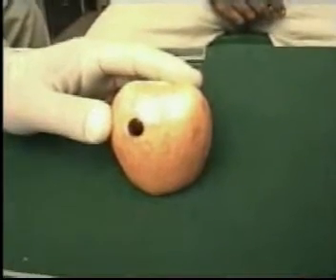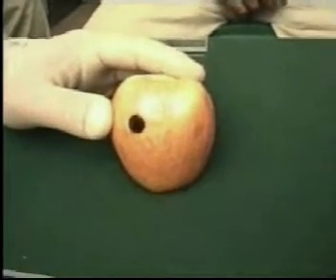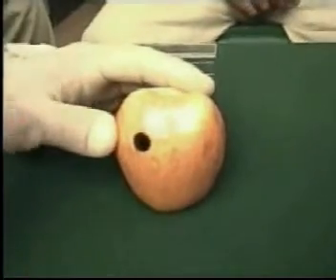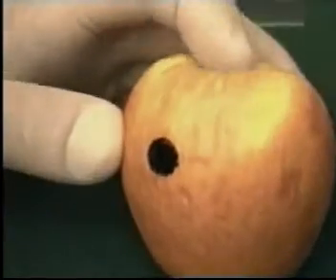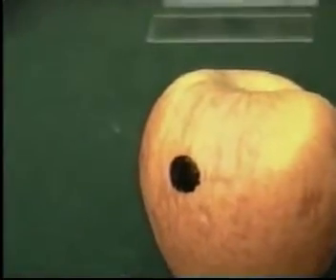This apple is a simulated growth — let's say in the breast or thyroid. The black spot marks the area of skin under which this lesion lies. Now we shall perform the FNAC.